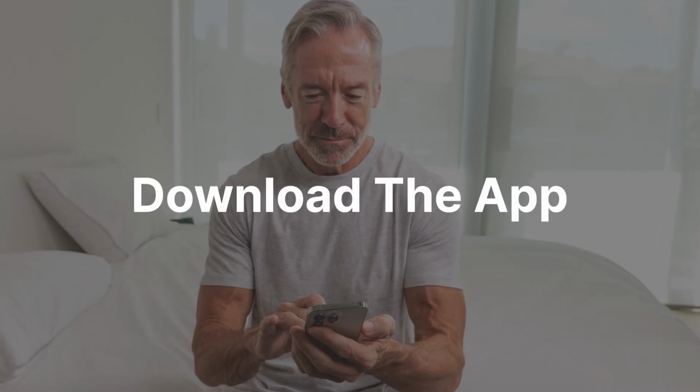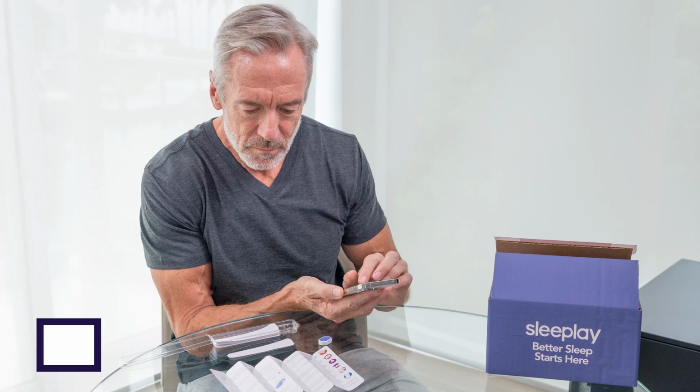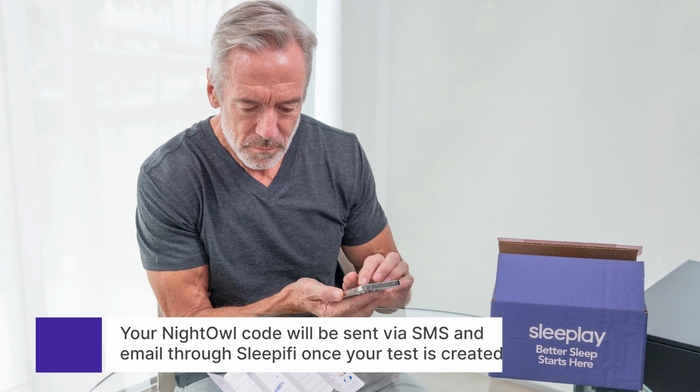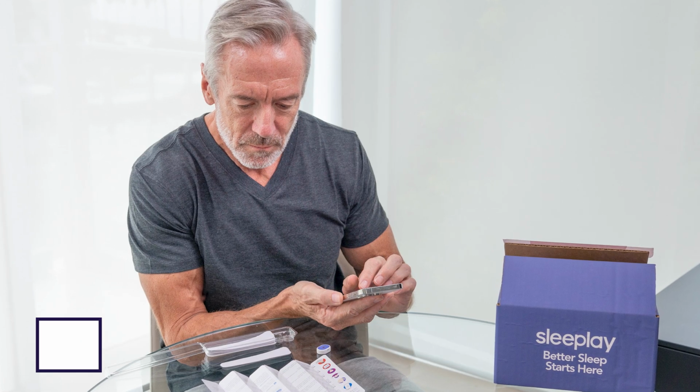Step 1. Download the app and activate. Start by downloading the NightOwl Companion app from the App Store or Google Play Store. Open it, create your account, and enter the activation code we sent you. This connects your device to your sleep doctor's care.